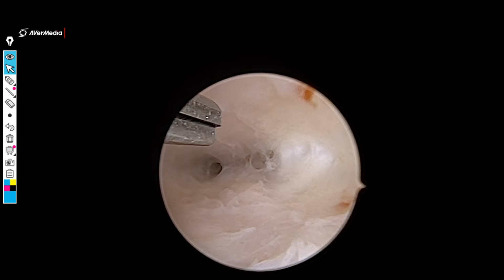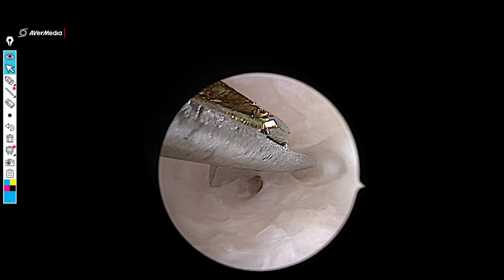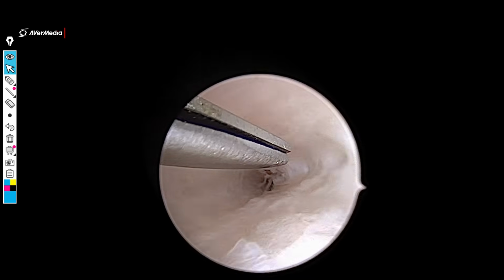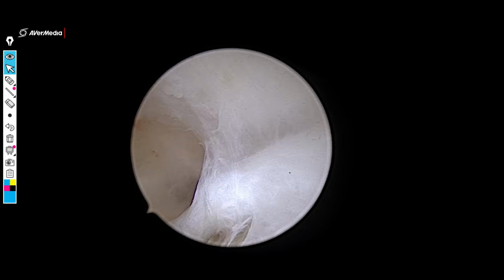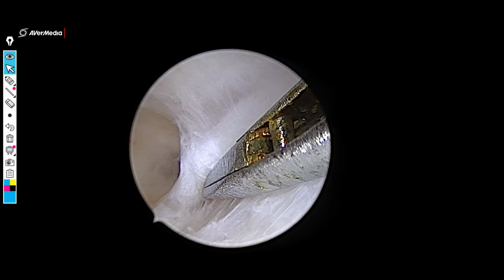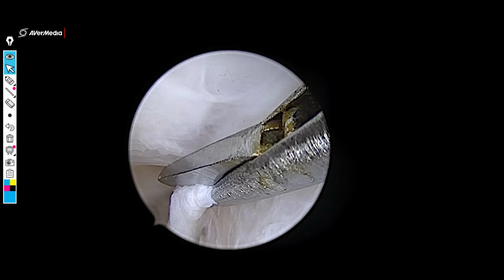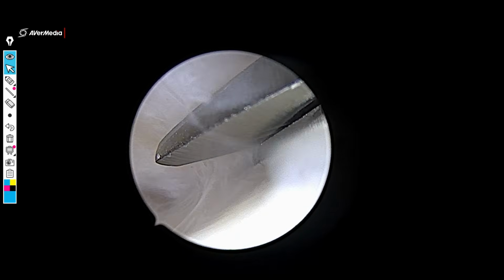Now, this has to be done purely based on experience and judgment, where there is no way to exactly predict where the fundus is and how deeper you should go before you will perforate the uterus. Now, what I have visualized seems to be the correct ostium. So, I am going to consider that it is the ostium, and we will do the correction of the left half of the uterine cavity, which is seen now on the right of the screen.